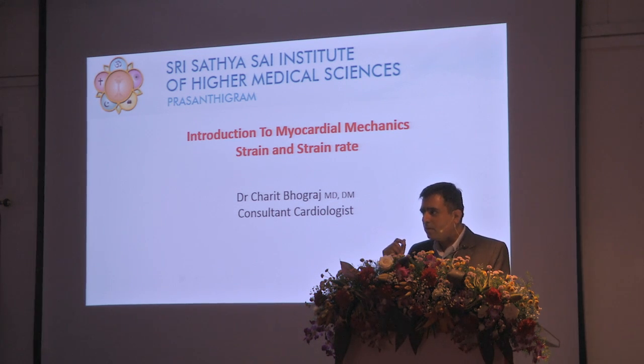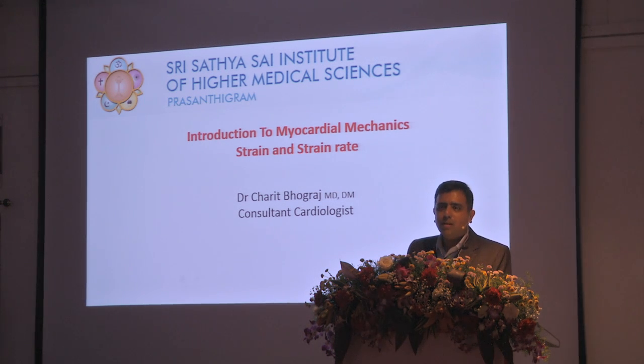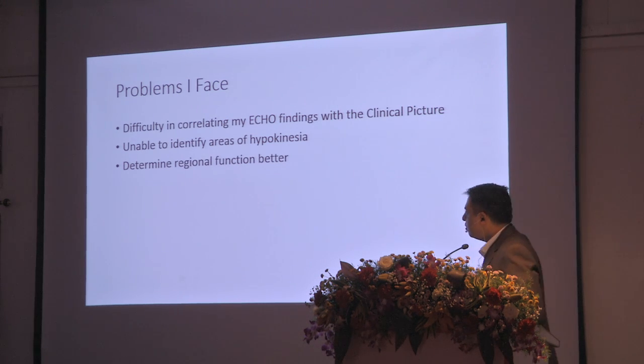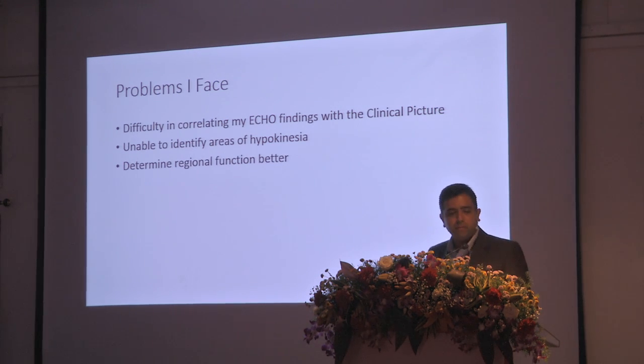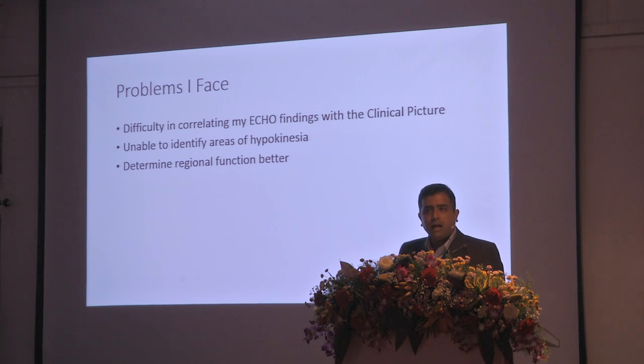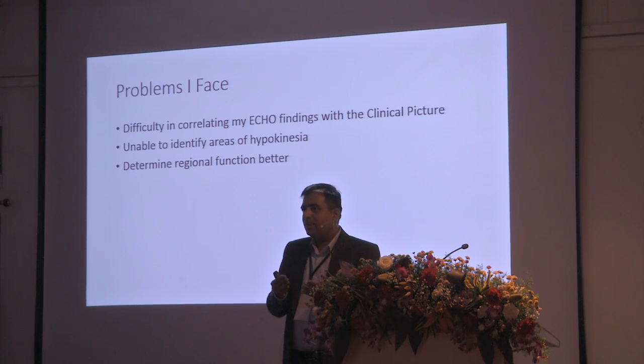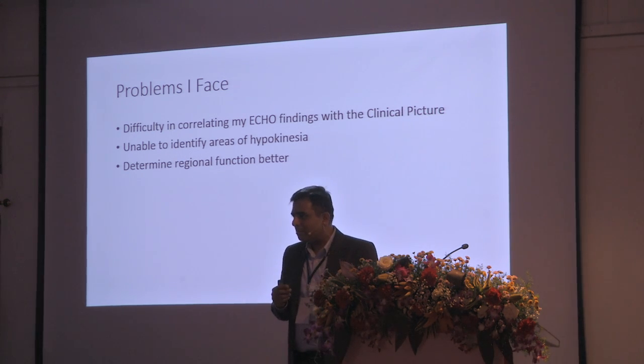It is important for us to understand how the heart functions, and only then will we be able to guide, treat, and make people better. So here are some of the problems that I face, and I have to be honest, in my routine clinical practice. There are times where I know the symptoms of the patient and my echocardiographic findings don't quite match. And I'm sure all of you would have faced the same thing.